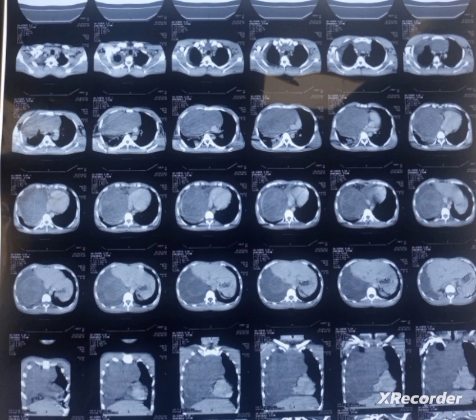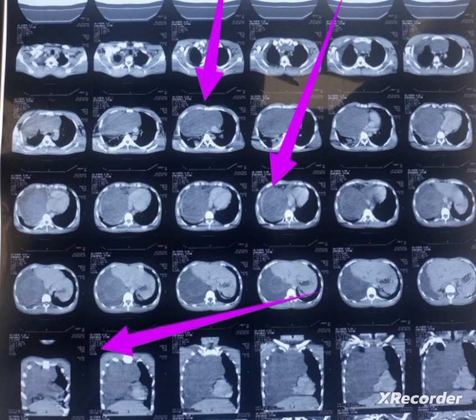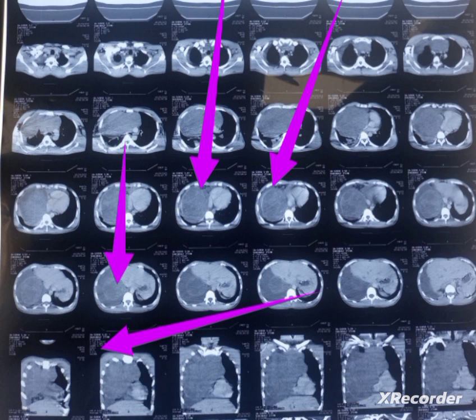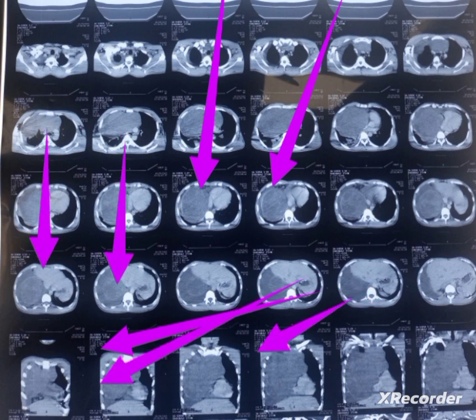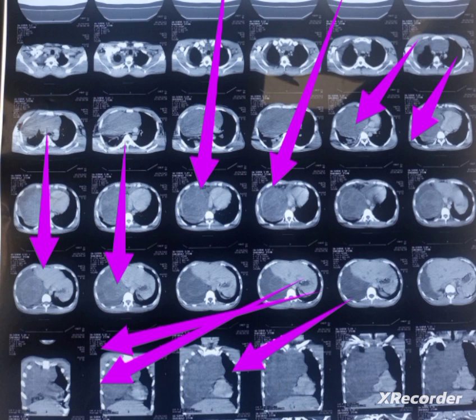As you can see here, there is a huge mass involving almost the entire right hemithorax — upper, mid, and lower zones — with sparing of the costophrenic angle, which you can see right here.